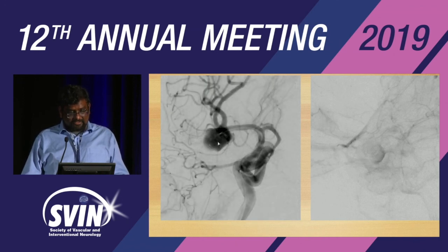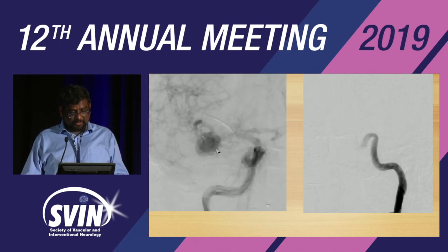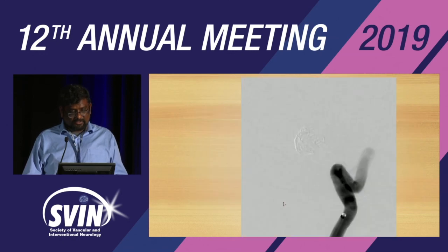So look at the axis of this WEB device. Okay, I knew this is undersized. So after detachment, look at what happened. The WEB rotated, but we were prepared for it. So we actually put in a couple of coils around it.